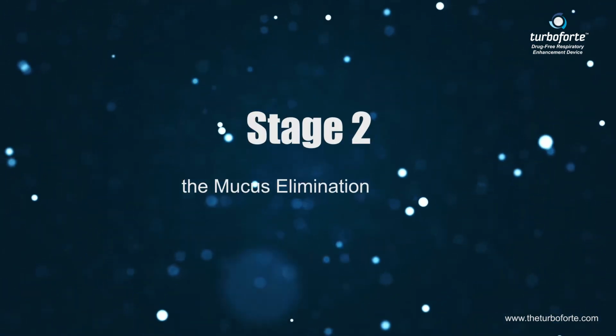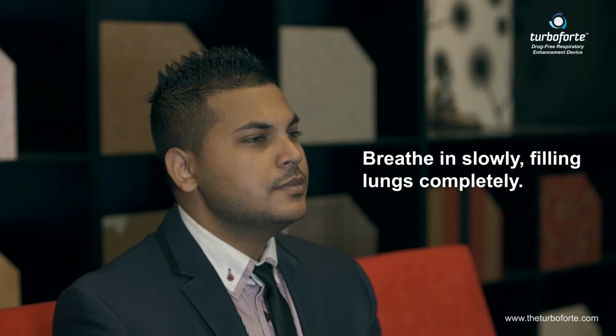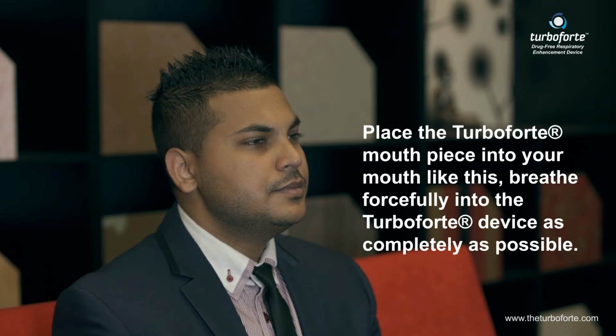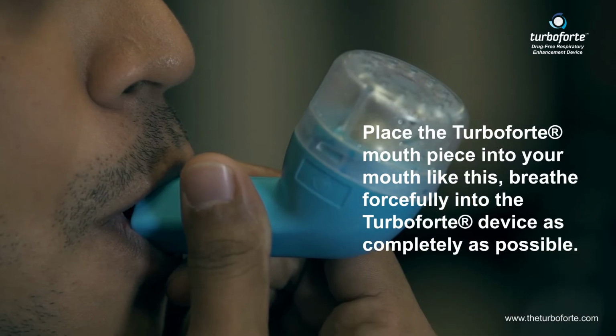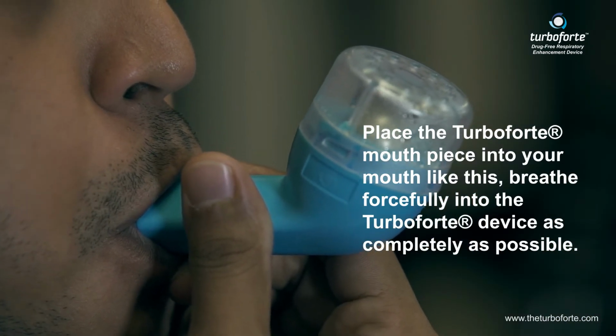Stage 2. The mucus elimination process. 1. Breathe in slowly, filling lungs completely. 2. Hold breath for 2 to 3 seconds. 3. Place the Turboforte mouthpiece into your mouth like this. Breathe forcefully into the Turboforte device as completely as possible.